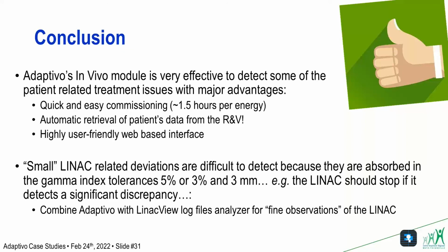And also it had major advantages. So the quick and easy commissioning, as I told you, 1 or 1.5 hours per energy. So the automatic retrieval of patients' data from the R&V is very effective and very important to save time for us. And it's highly user-friendly.